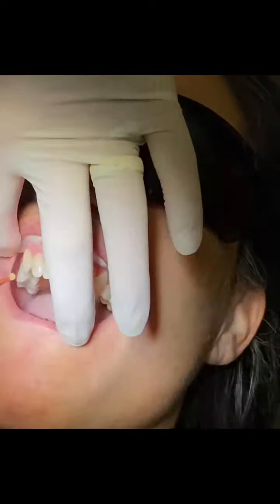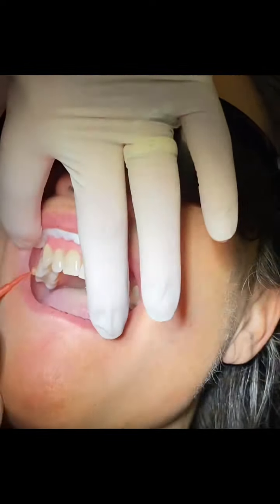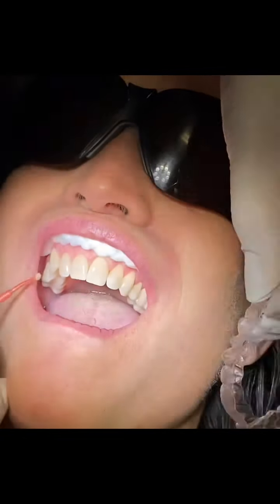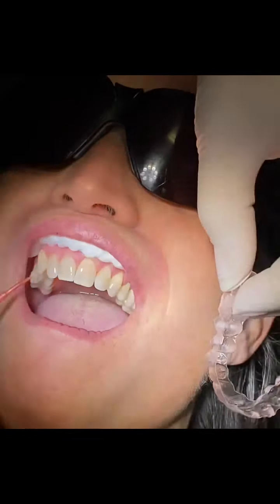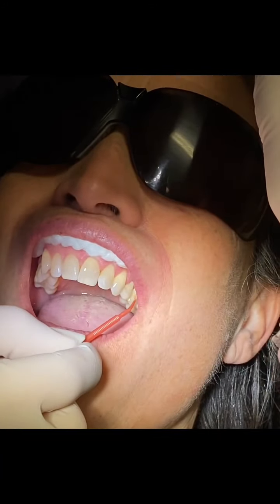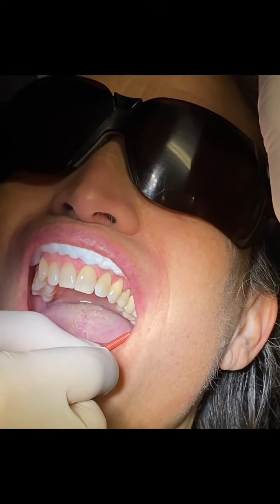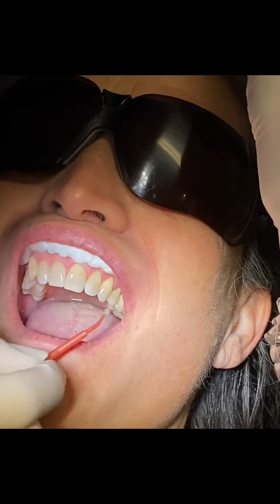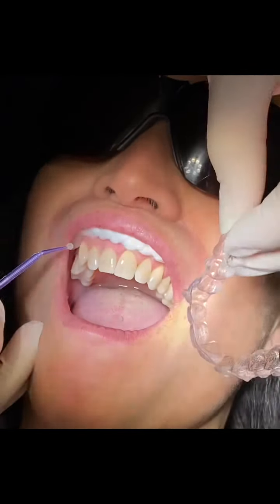One thing I did not mention is that we do heat the enamel flowable material. We heat all our composite resins, so it's no surprise that we heat this too, but we find it works a whole lot better once heated. The handling efficiency is much better.